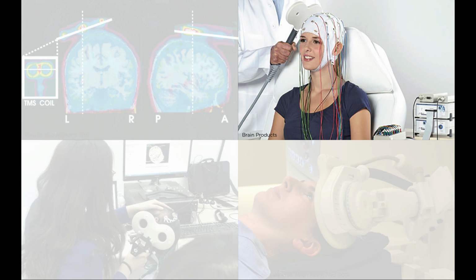And also the amplifiers need to be protected from the TMS artifact. The most difficult thing to handle in combining TMS and EEG is the large artifact that is created by the magnetic stimulation. And so there have been several hardware modifications to the EEG amplifier, for example, allowing for high dynamic range so that you can record the signal.